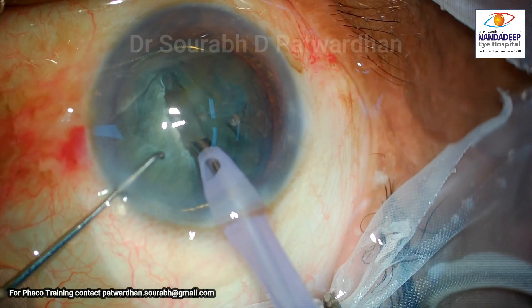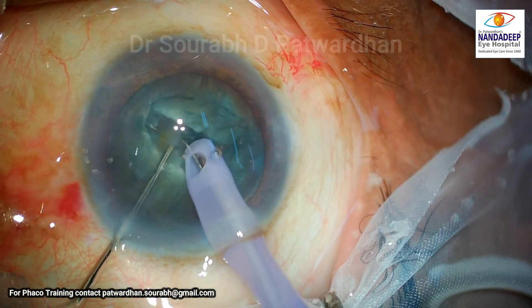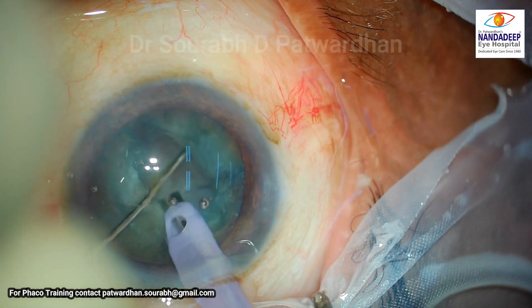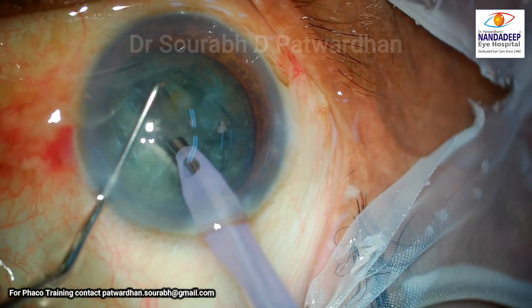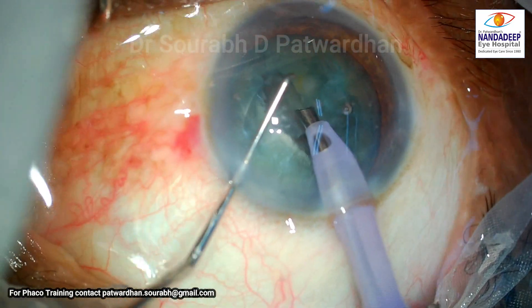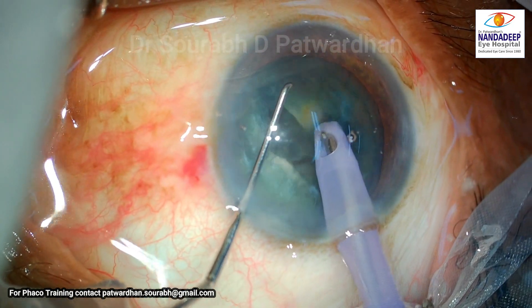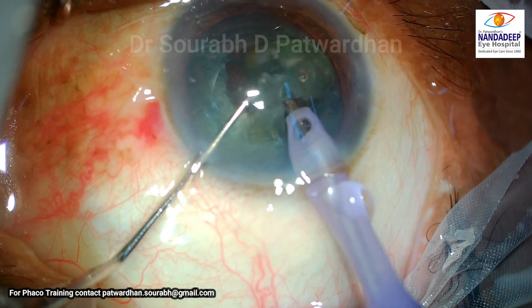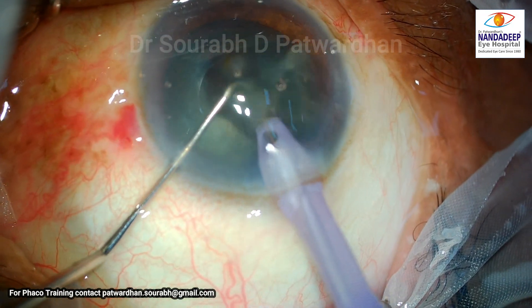A central deep trench is what is recommended — we don't need to go to the periphery. I would put the instruments a little deeper in the trench to divide. Being a soft cataract, it got divided, but I would rather prefer putting the Sinski hook and probe to a deeper level. Here the surgeon starts removing what is not a quadrant actually, but the hemi-nucleus.